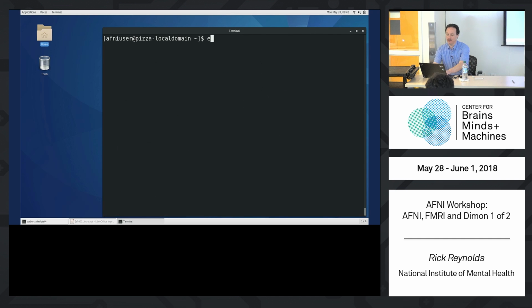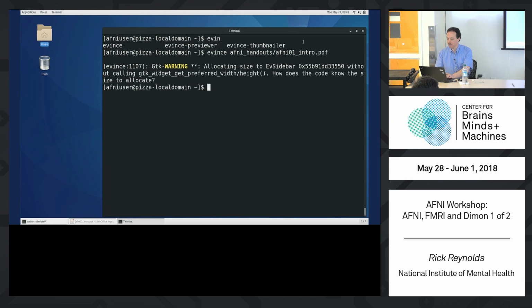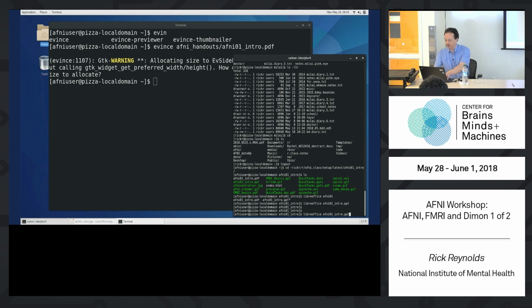For this class, do whatever you want. On a Mac, you probably just use your GUIs, go into the directory and double click on it, or you can type open space AFNI handouts / AFNI 01. Yes? So good, everybody have that open? If you don't, just raise your hand and Daniel and Gong can come by and make sure things are good. I'm not going to use the PDF, I'm going to use a PowerPoint, since Bob has already set it up to ignore some of the slides.